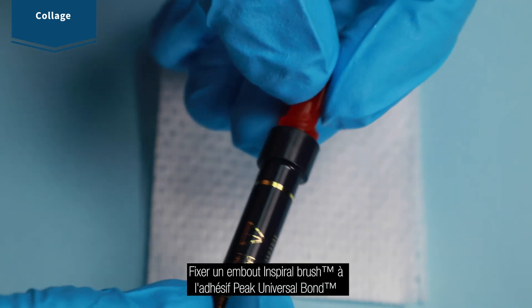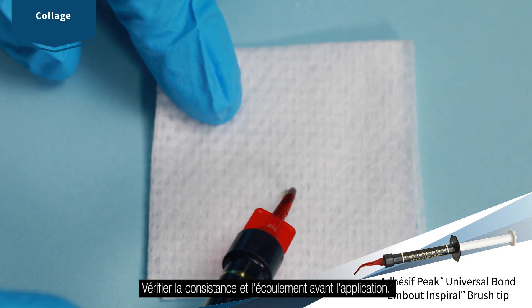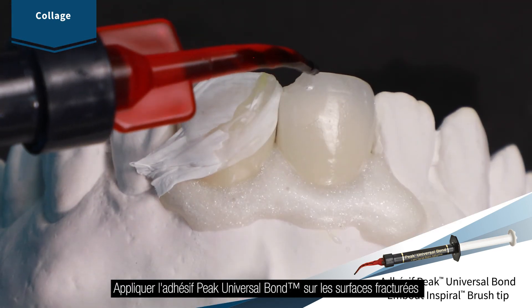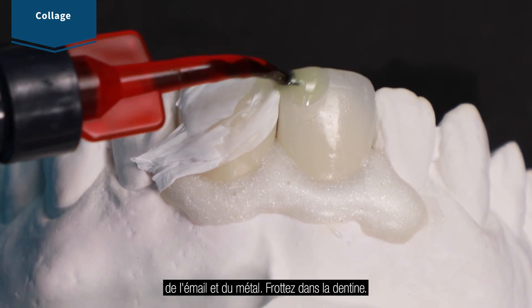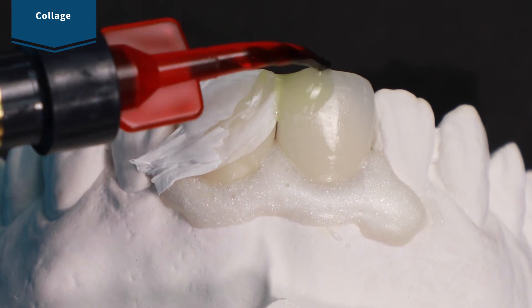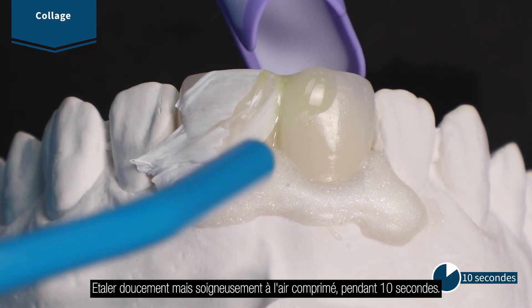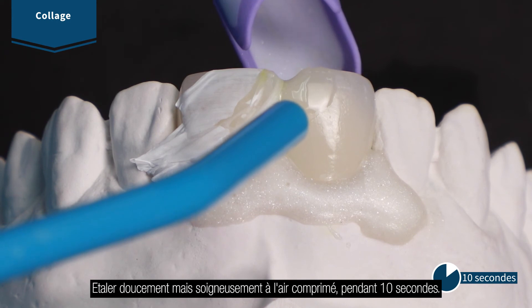Attach the Inspiral brush tip to peak universal bond adhesive. Verify flow and consistency before applying. Apply peak universal bond adhesive, painting it onto the porcelain, enamel, and metal. Scrub into dentin. Air thin for 10 seconds using quarter to half air pressure. The prep should appear shiny.